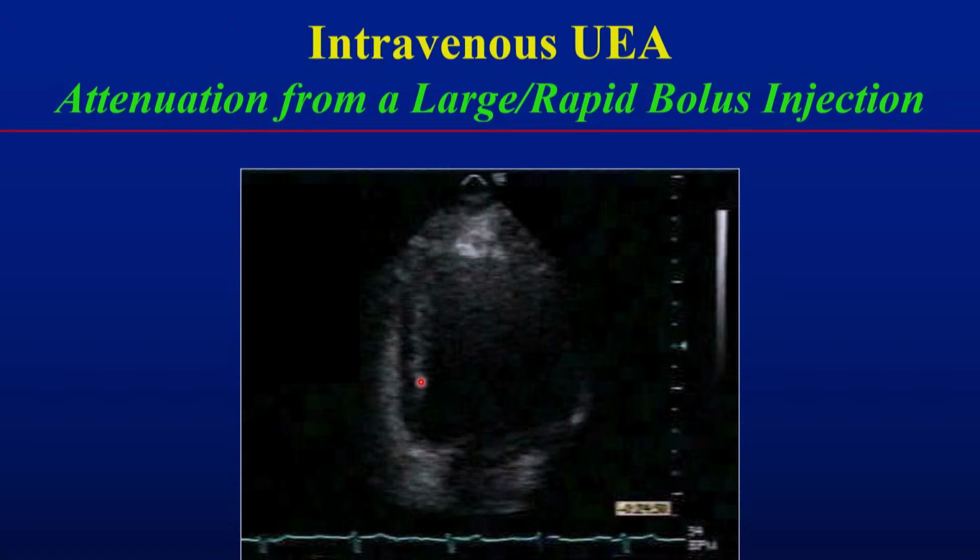And the reason for it is the ultrasound beam is coming this way, and this is very dense. So it's going to reflect the ultrasound only of this surface. All this area here will be black, because it's hiding behind, it's attenuated. It's almost like you have a piece of calcium or metal because it is so dense.